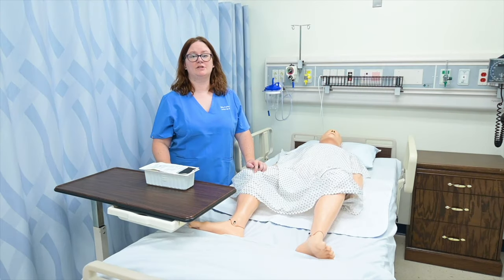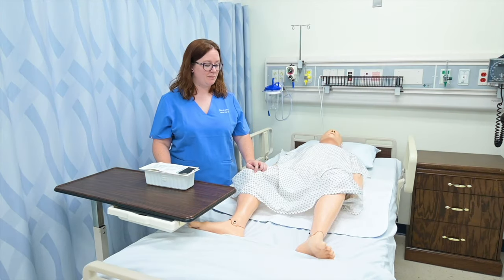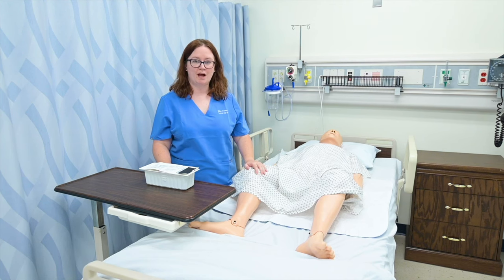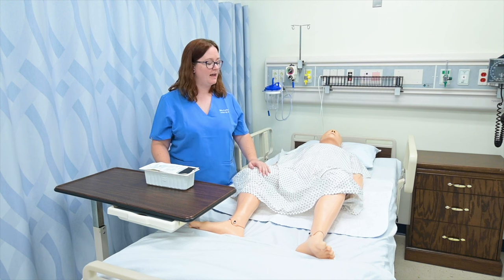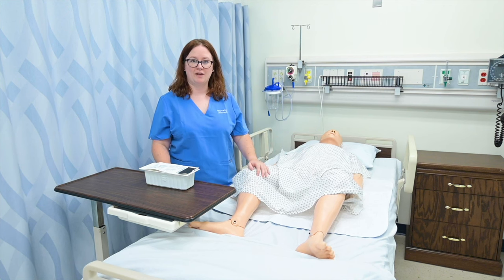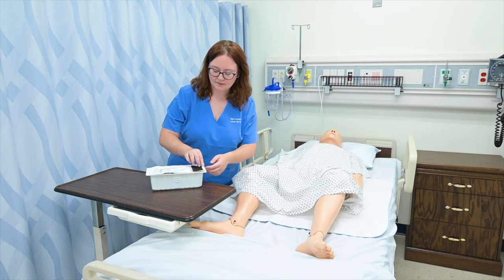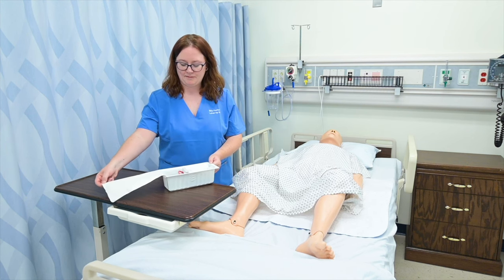Before I do a straight catheter insertion on a female patient, I would make sure they are positioned in a dorsal recumbent position with their knees out and provide any perineal care that's necessary. Then I simply grab my catheter tray. So I'm going to go ahead and open that.